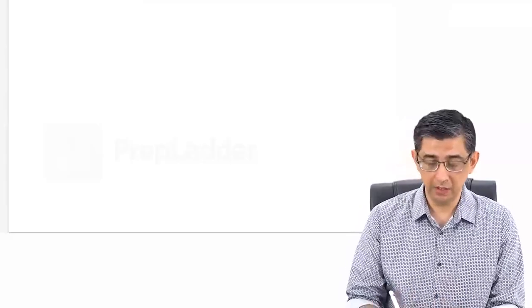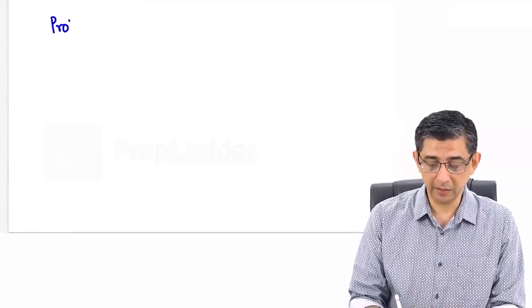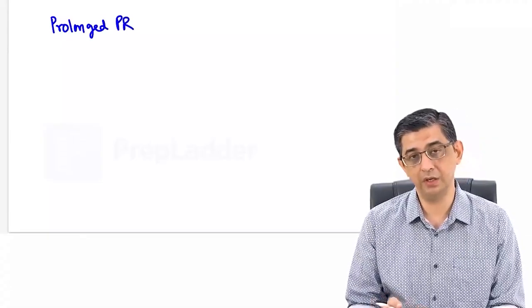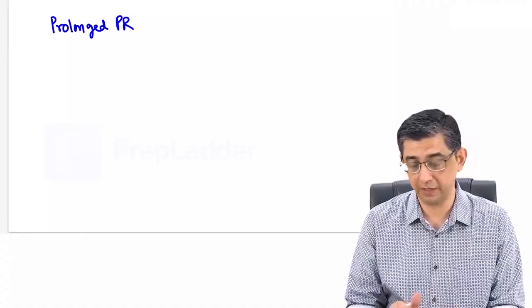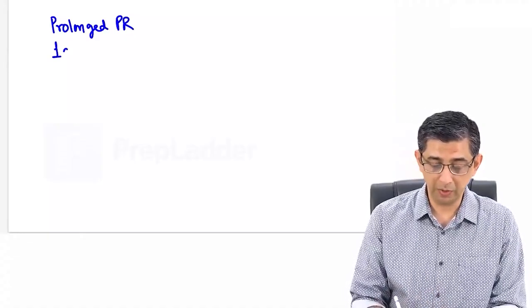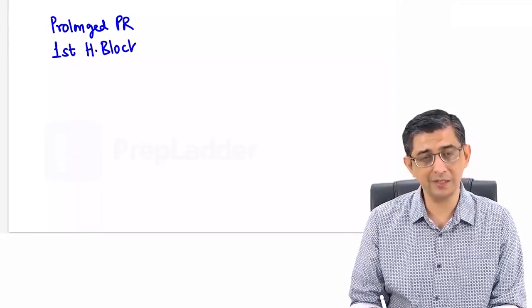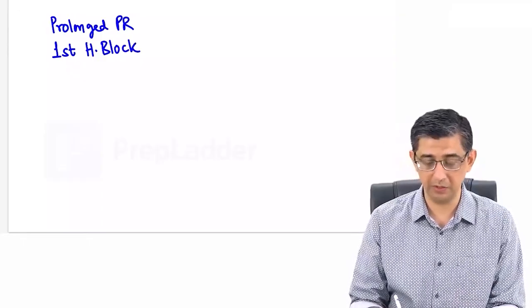The next component of the ECG that I'm going to explain to you would be aspects related to the prolonged PR interval. And here we shall be talking about the various types of heart blocks, that is first degree, second degree, third degree. So I will be drawing a couple of line diagrams here where I'll try to explain how you can easily differentiate in a limited time frame between these various varieties of heart blocks. The problem is that the person will be having effort intolerance, and there could be pre-syncopal attacks, there could be even syncope developing in the patient.